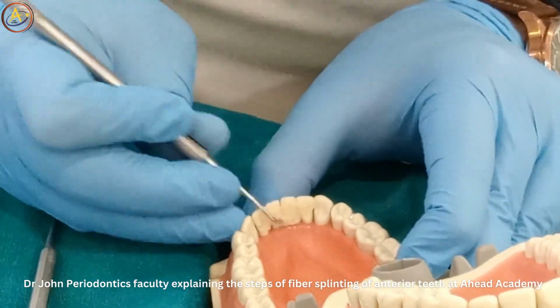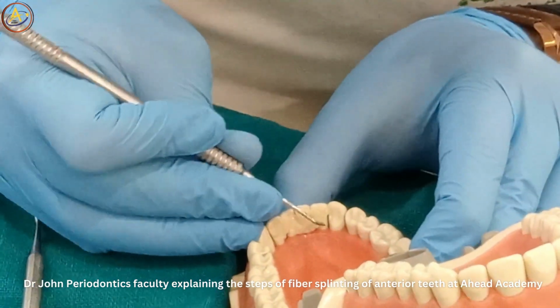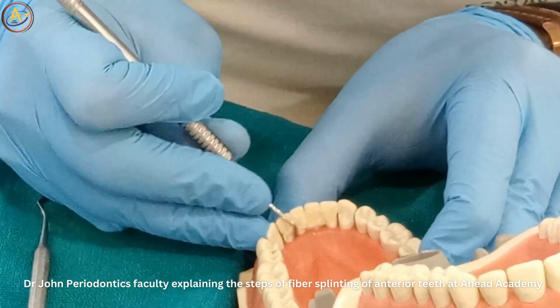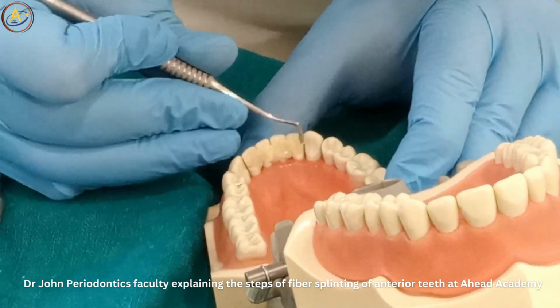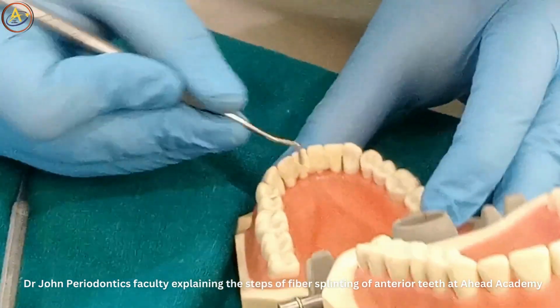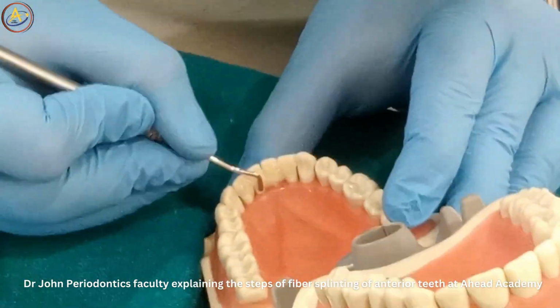Now if you leave the cervical part, he will have food lodgement, so you trim this main, that is your cervical. Okay, remove the extra so that at least food can pass along all the areas. Trim it, press it. Okay, now is something left on this, or should we do something more?